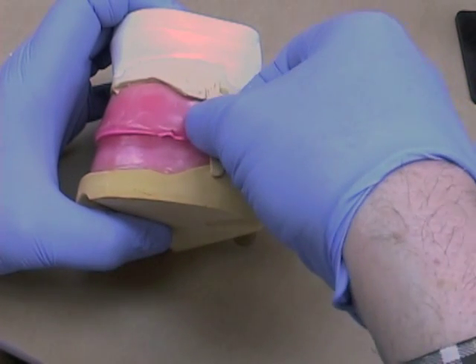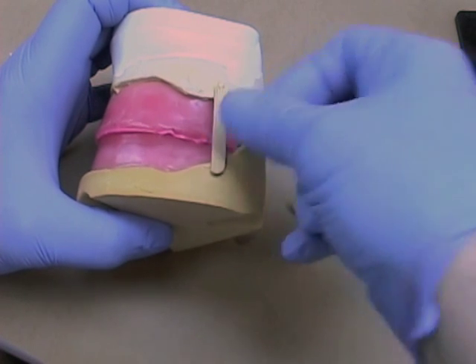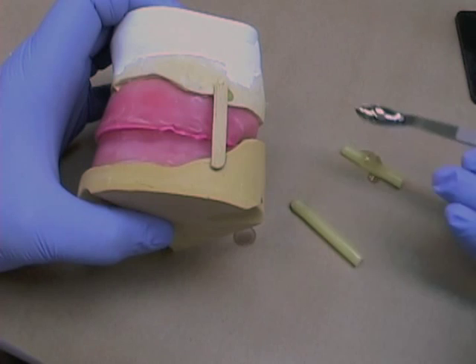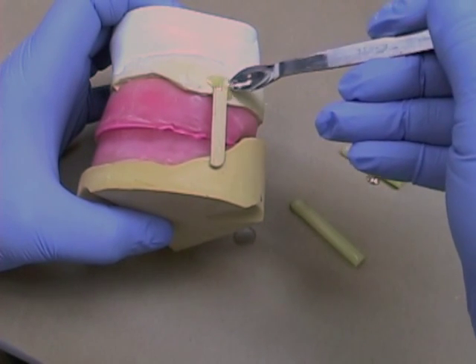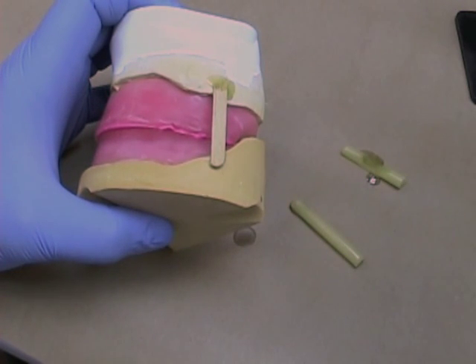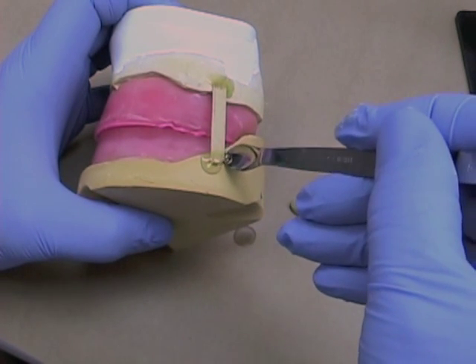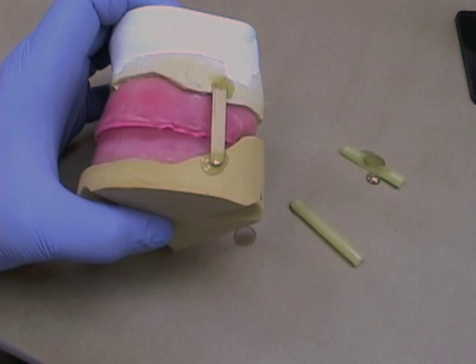While the wax is still molten, press the stabilizing stick into place between the maxillary and mandibular cast. Then use a hot wax spatula and some more sticky wax to sear the wax and seal it to the cast. It won't stick as well if your casts are damp, so make sure they're dry.